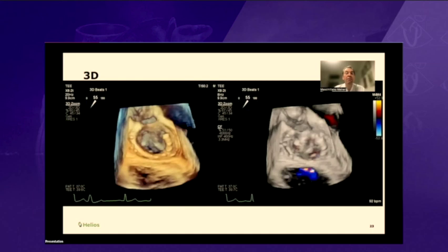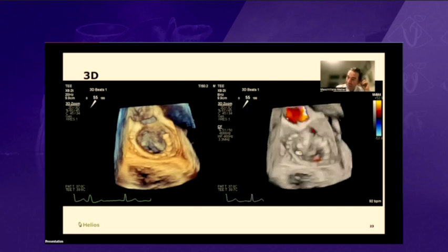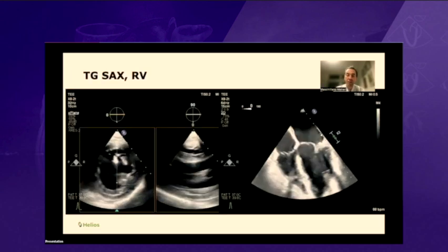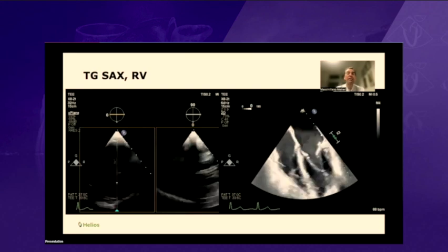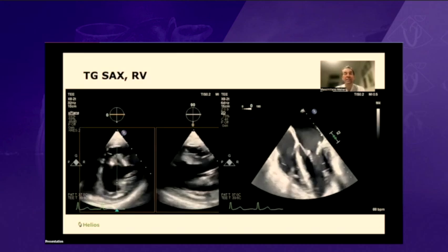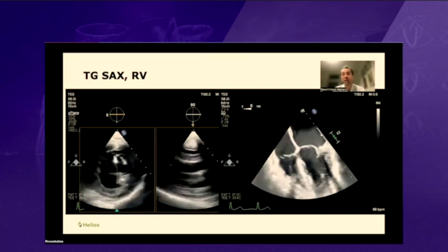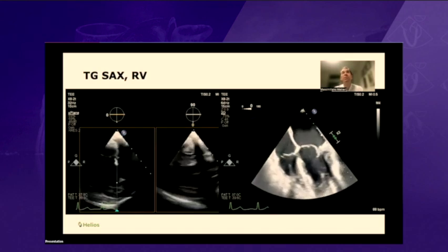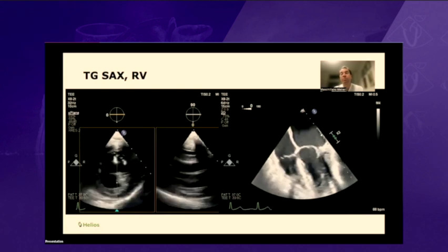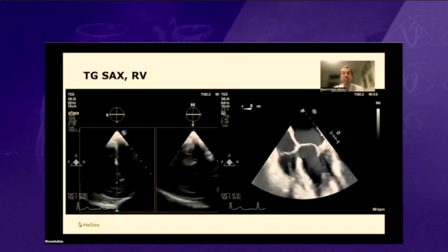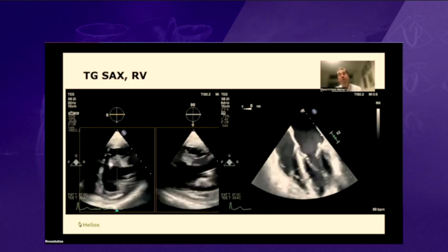With 3D, looking down you can see the ring on the left and two small jets on the right. One is a bit bigger on the right side, which is more medial — that's where the P3 segment was tethered down into the ventricle. We confirm there's no wall motion abnormality in the short axis view. Despite already seeing flow in the circumflex, we confirm with a normal short axis view. For these procedures, we also need to guide weaning from cardiopulmonary bypass — the surgeons don't see the right ventricle because the chest is closed, so echo must assess both ventricles.